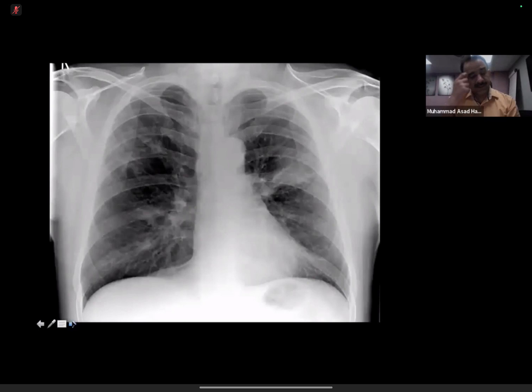Now, this patient basically had fibrotic change secondary to rheumatic disease, and this is the patient's X-ray after the steroid therapy, so it was not a malignancy. Okay, that is just to highlight the importance of the biopsy to manage the patient. Okay.